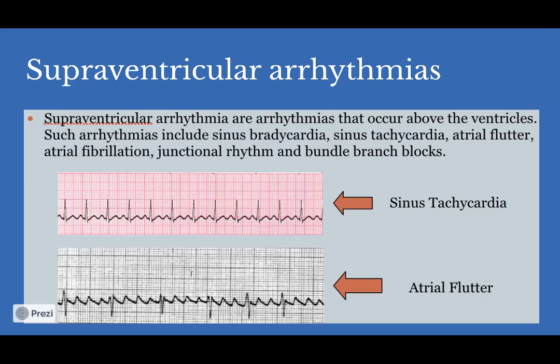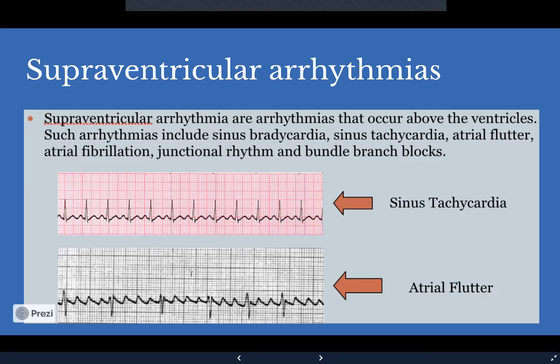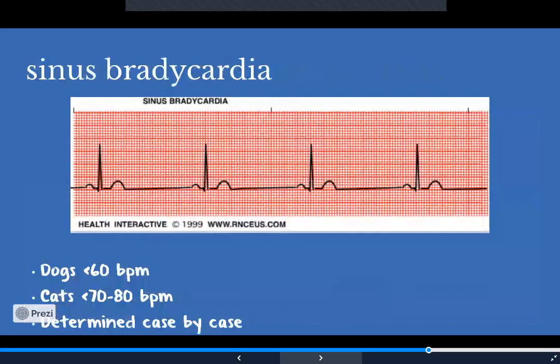And atrial flutter, it sounds like it should be pretty, but in all actuality, it sounds like tennis shoes in a dryer, so it doesn't sound good. And it looks like a horror show to me. That's sawtooth marks, right? And so it's not like fluttering through space, okay? If you want to think of a bee buzzing through, it's like a sawtooth, right? It doesn't look like a bee buzzing maybe through a storm, you know, getting blown around. I don't know, but it's a sawtooth. It's not pretty. So just remember that. It's not exactly what you think it should be.